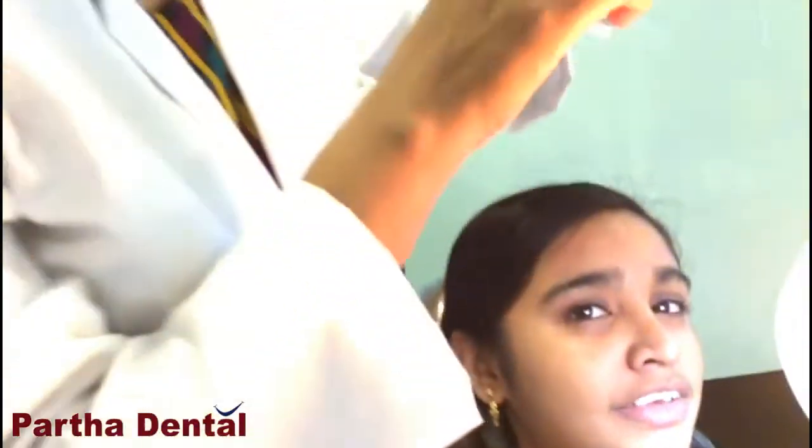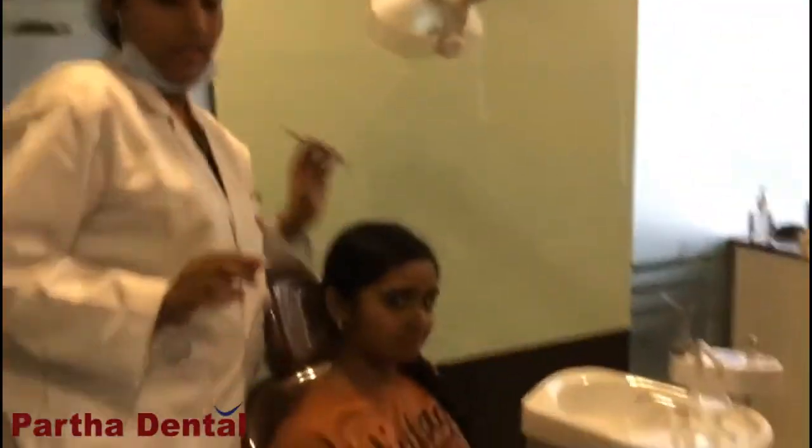We have advised her extraction. She has tooth 30 affected, and she has the option for dental implant surgery — tooth 30 will be replaced with a dental implant.